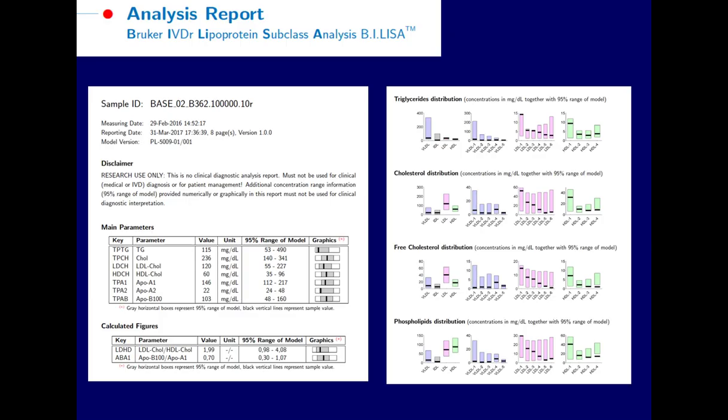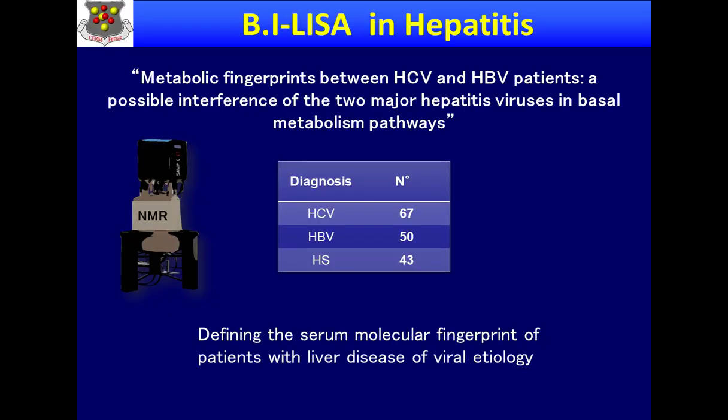Now, you have seen this from Manfred, so I don't need to go through it. You have seen that this report is very detailed. This is for lipoproteins, and also you have seen that there is a very detailed report for small metabolites, small molecules. And we have a few examples that are all in progress, all very preliminary, and nothing is published, so I cannot even give you so much details. But we have actually started using this IVDR from Bruker, this predictor.